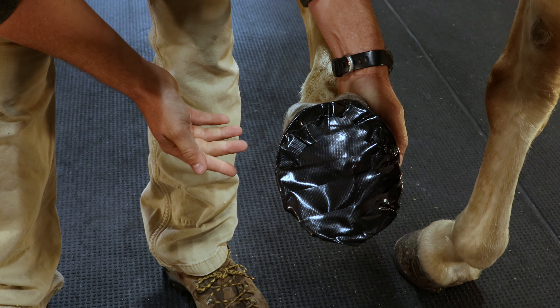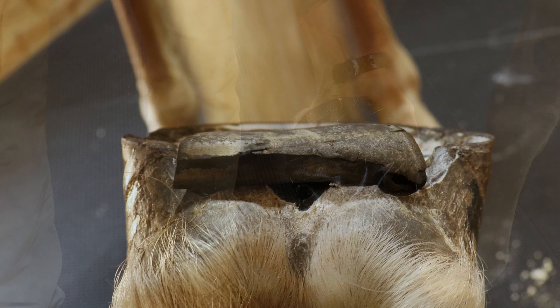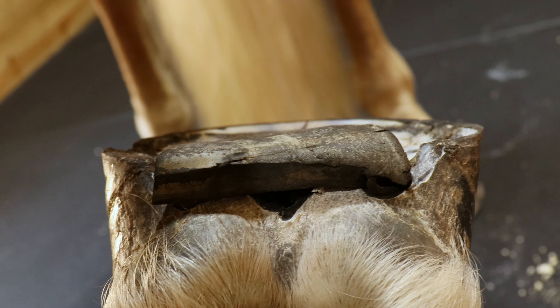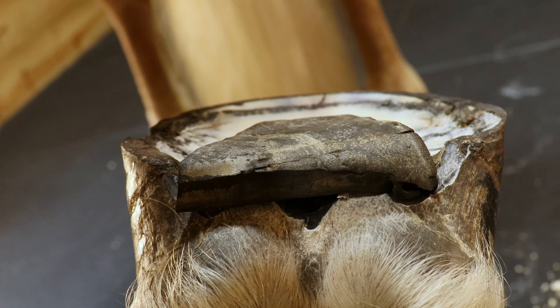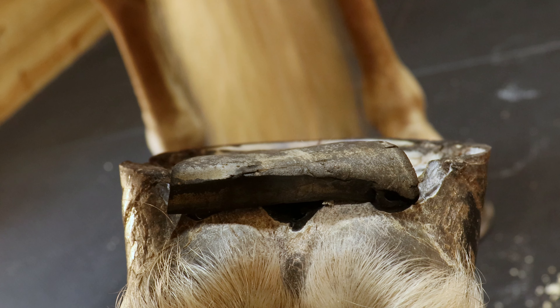That should stay on pretty tight for a couple of days. If you need to add more duct tape, you can do that. The important part about applying a frog pad is that whether the hoof is shod or unshod, you want the frog pad at the same plane as the hoof wall or the shoe to be effective.